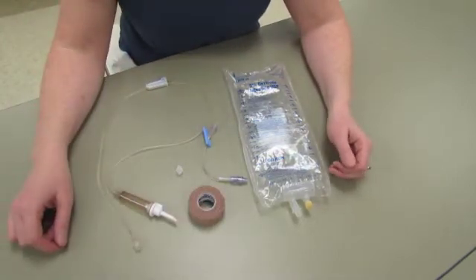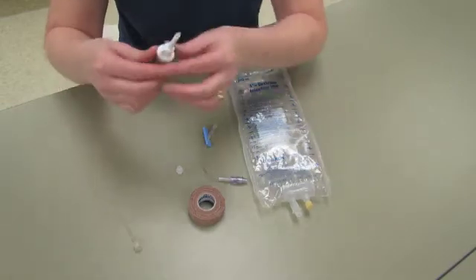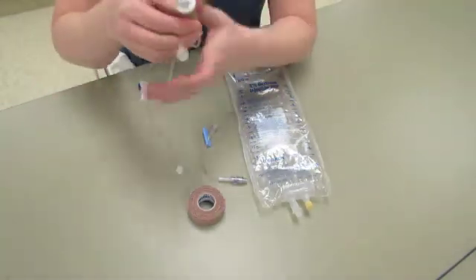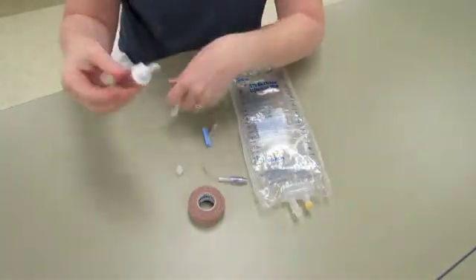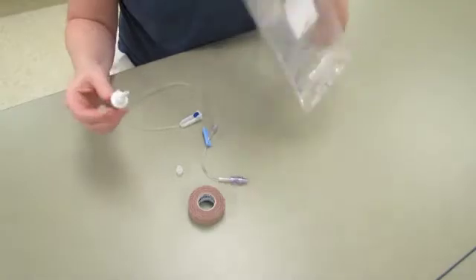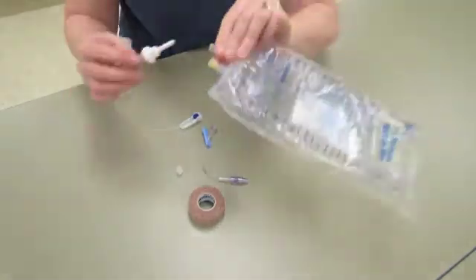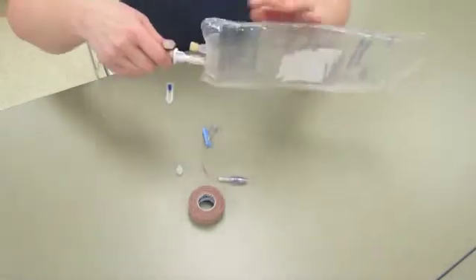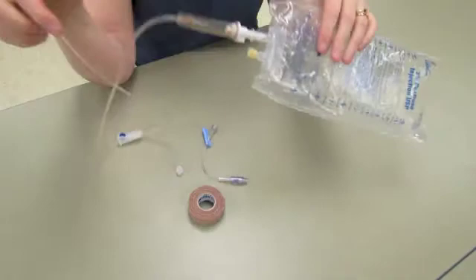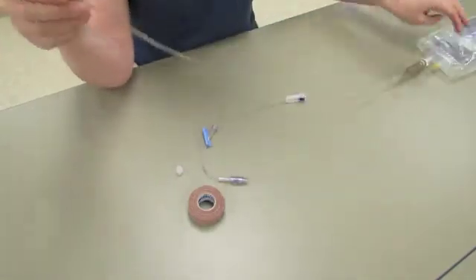This system is incredibly easy and very inexpensive. All that you would need for each patient is one used secondary tubing, which you put into a used empty IV bag. I find that the 1,000 milliliter ones are better because you can hold a lot of fluid before you have an explosion underneath the patient's pillow.